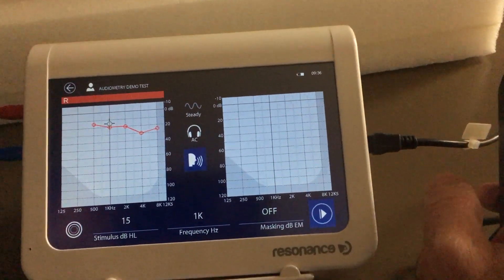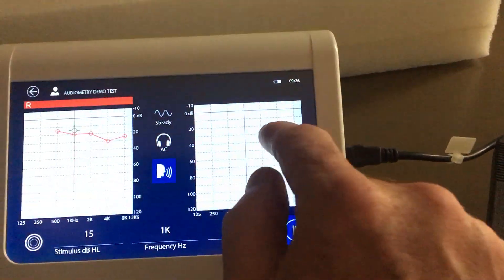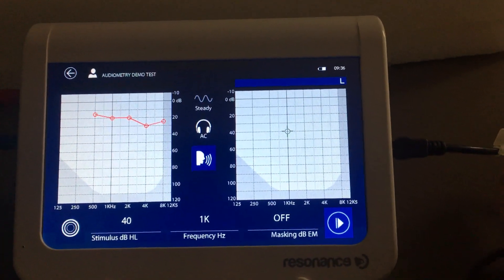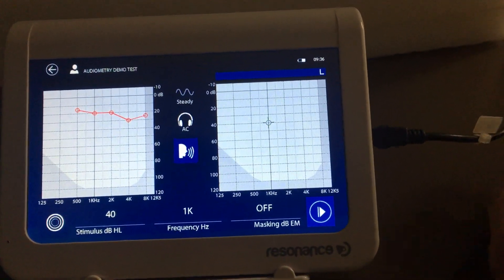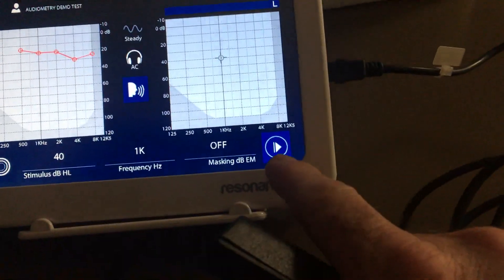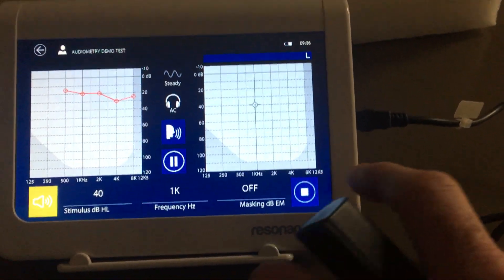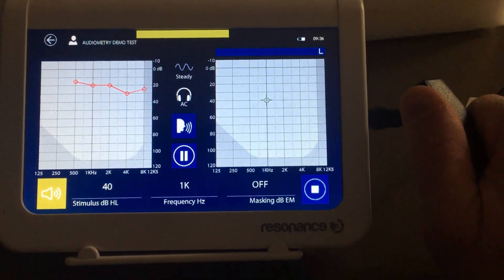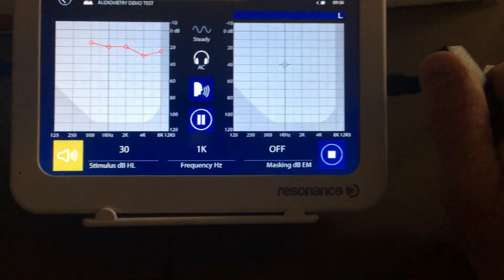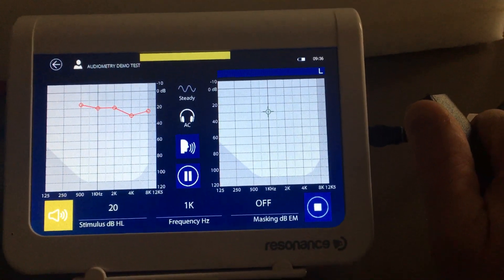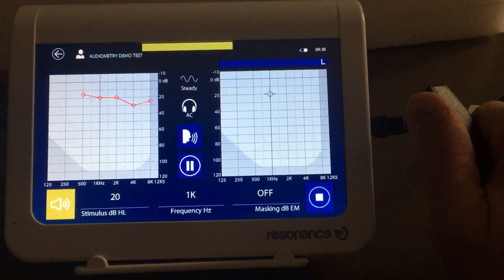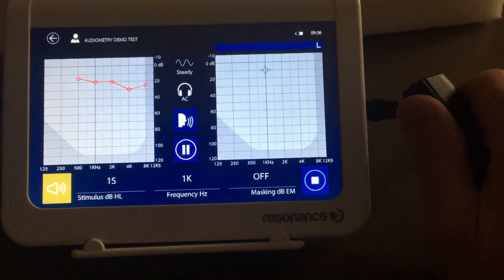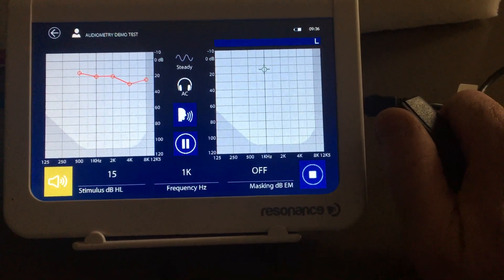Now you're done on that side. If you want to switch sides, you just tap that side and then do the left side. Hit the play button and they'll see the tone. They hold the button down while they hear the tone, and let go of the button when they no longer hear the tone.